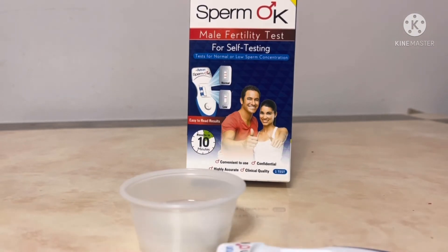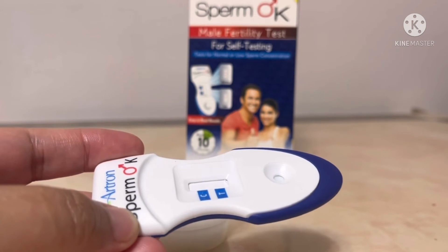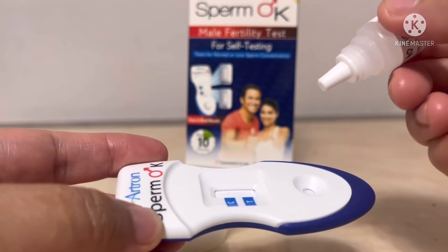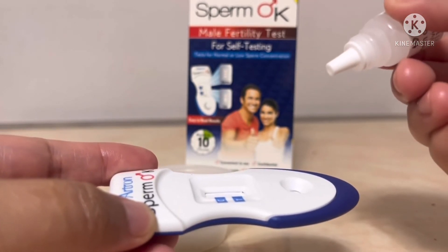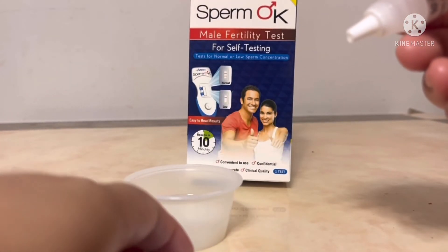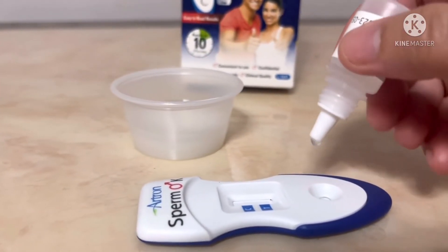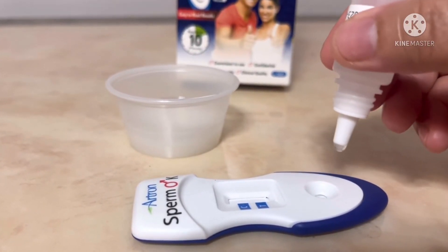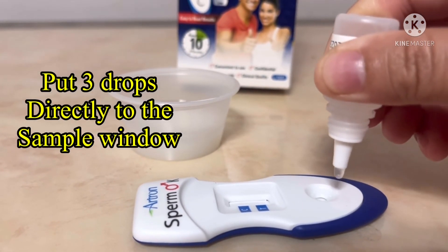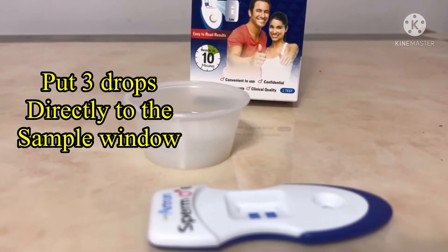It's time to put the solution here — three drops. Now we put the specimen, the sample here, after two minutes. It's got to be flat. So just one, two, three drops. That's it.